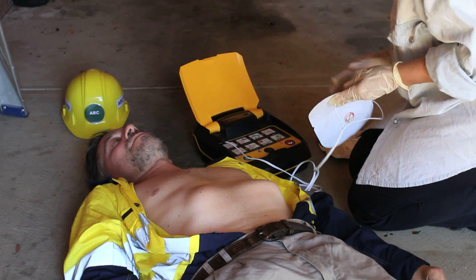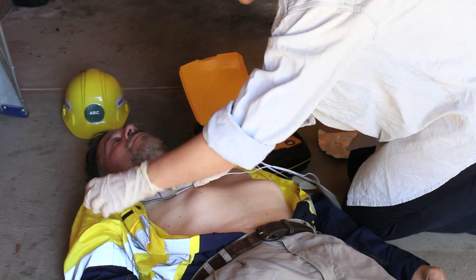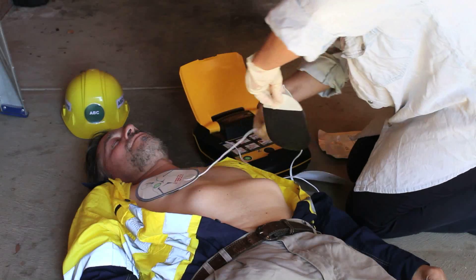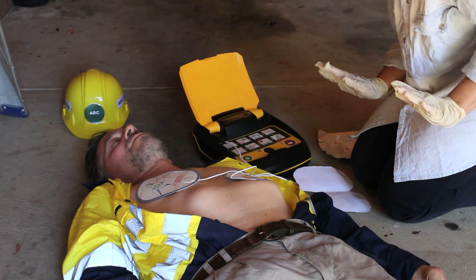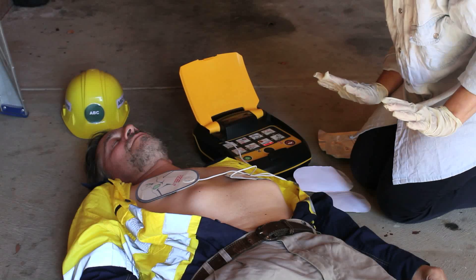Remove clothes from the patient's chest. Place pad exactly as shown in the picture. Press pads firmly to patient's bare chest. Analyzing heart rhythm — do not touch the patient.